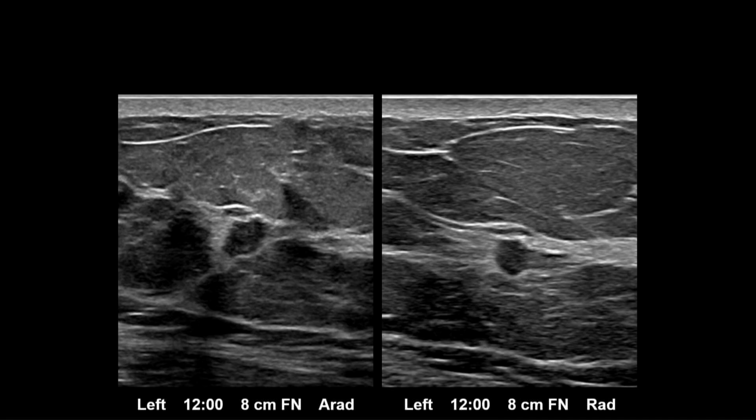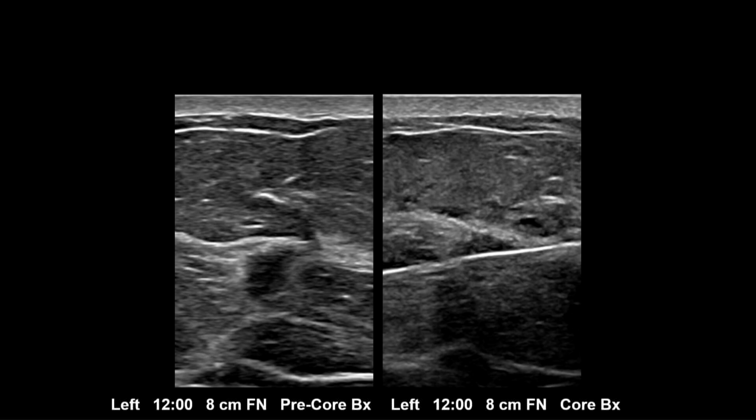And that means we've got to find it at ultrasound. And at ultrasound, it's not typically benign. It's certainly not a simple cyst. Here, it's vertically oriented. It's taller than wide. It's somewhat irregular in shape on this image. This is going to be biopsied, even though it's tiny, it's like 4 millimeters. And there it is being biopsied.